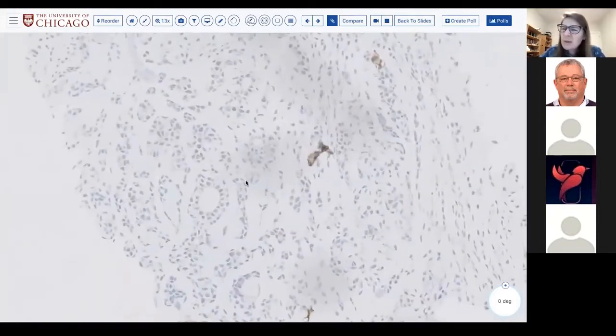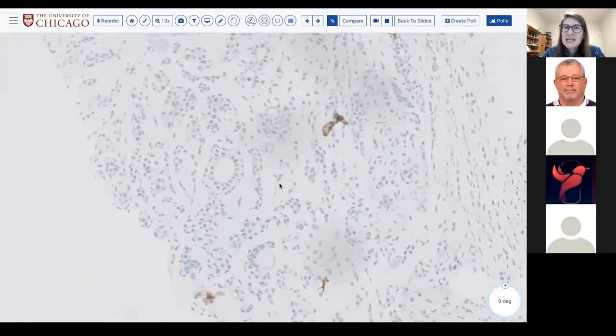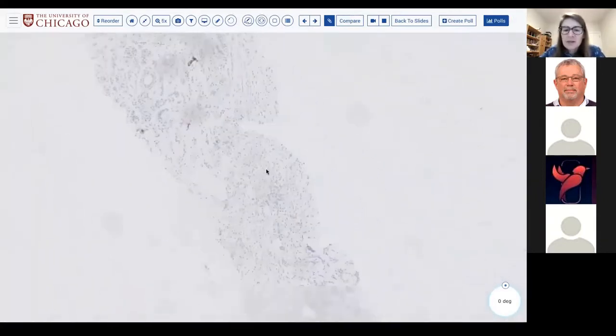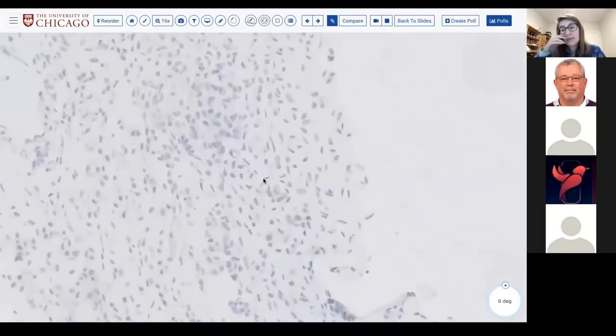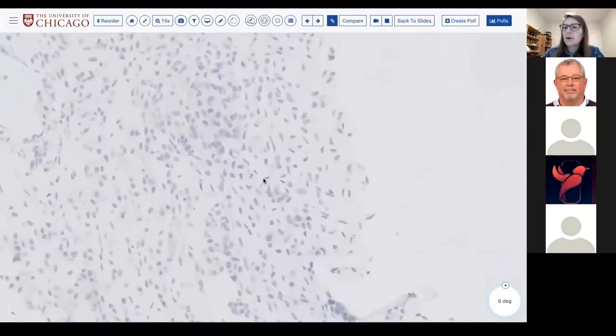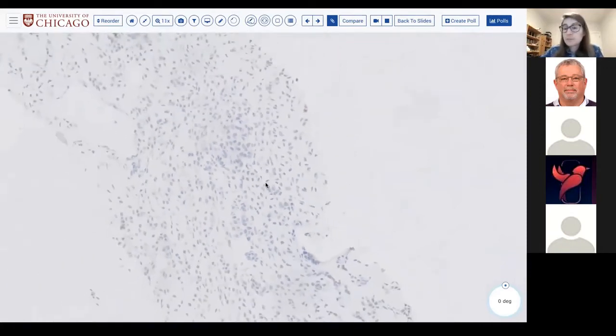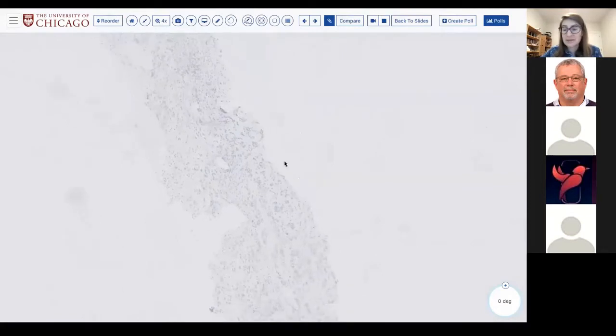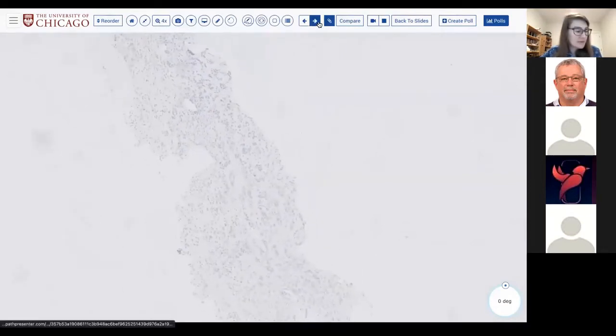So, when you think about myoepithelial cells or basal cells of salivary glands, in the neoplastic state, myoepithelial/basal cells can be quite challenging and quite immunophenotypically diverse, right? And so if they express contractile apparati, they may have SMA or calponin. If they don't, they may just be P40, right? And so we're dealing with a very heterogeneous phenotype of these myoepithelial/basal cell populations.